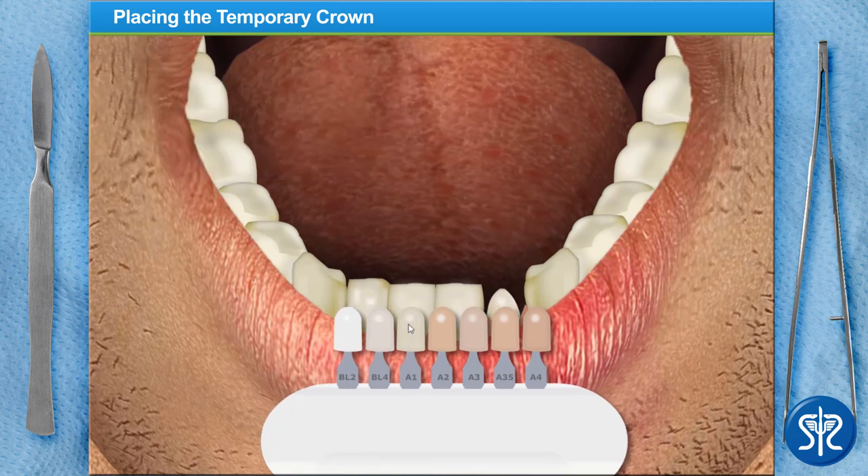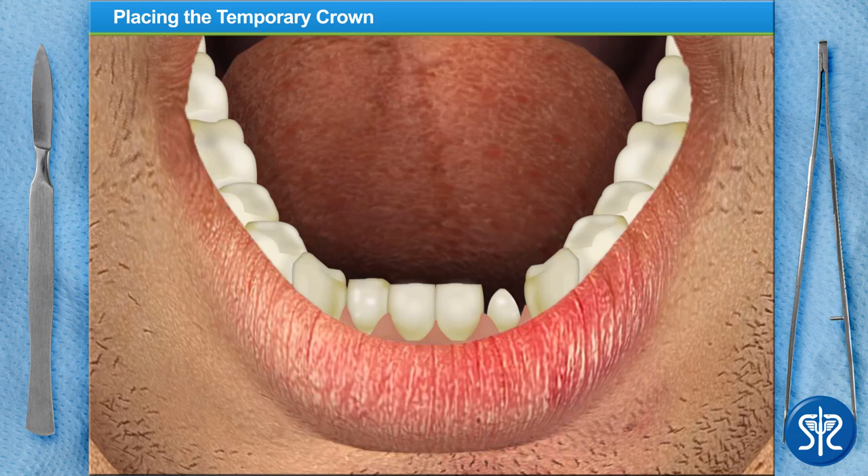That looks like a match! The last item on today's agenda is to place the temporary crown. The temporary crowns we use are prefabricated and made of plastic. I've already lined the inside of the crown with temporary cement, so go ahead and place it on the prepared tooth.